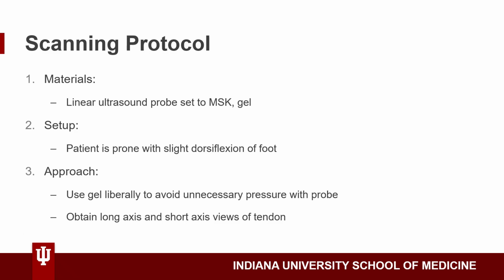It should be noted that patients with Achilles tendon injuries will likely experience tenderness or pain. Liberal use of gel will allow you to minimize pressure while still obtaining a clear image. This should also aid in the patient's comfort. Obtain a long axis and short axis view of the tendon.